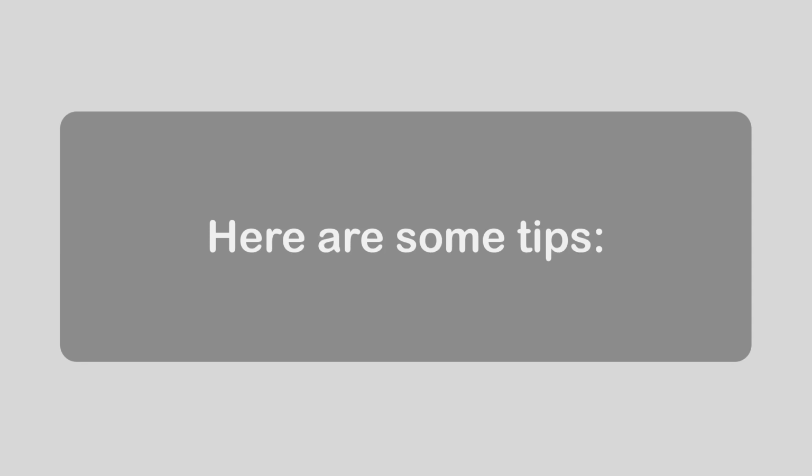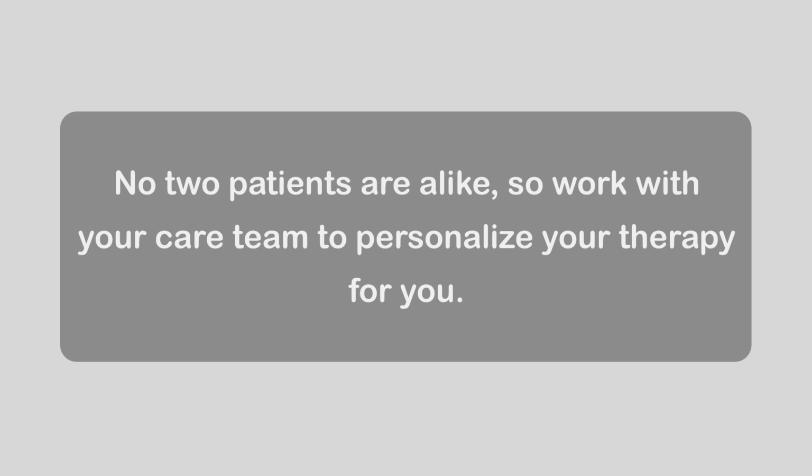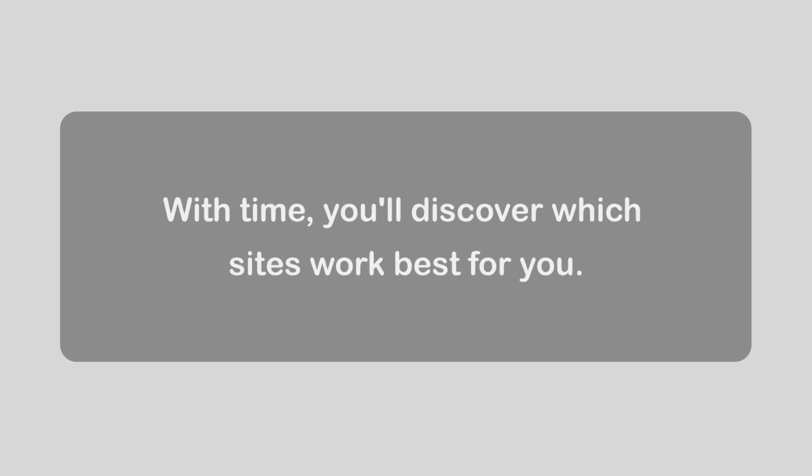Here are some tips. Infusion with the SCIg60 system is safe and simple. Thousands of patients have successfully mastered subcutaneous self-administration. No two patients are alike, so work with your care team to personalize your therapy for you. Some site irritation is normal and should diminish with time. Longer needles usually don't feel any different from short needles. In many cases, they work better and irritate less. With time, you'll discover which sites work best for you.